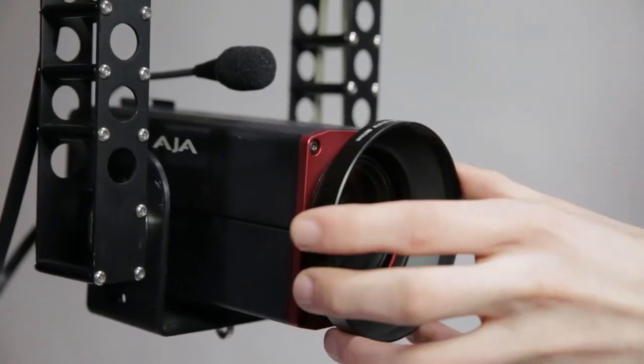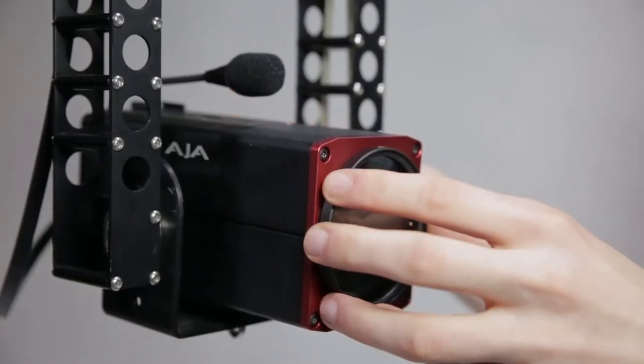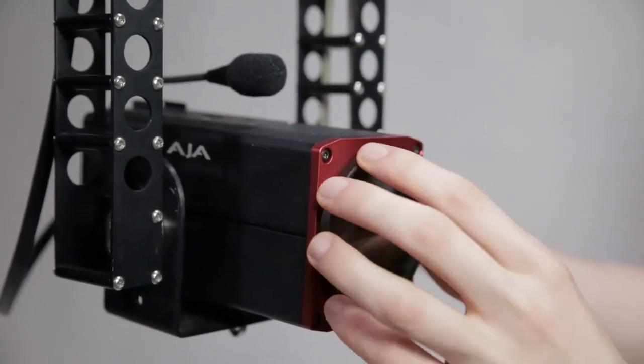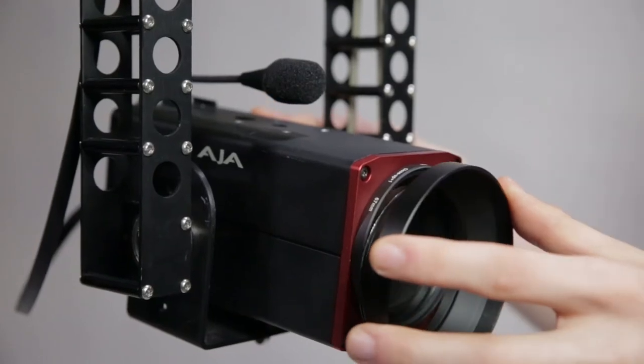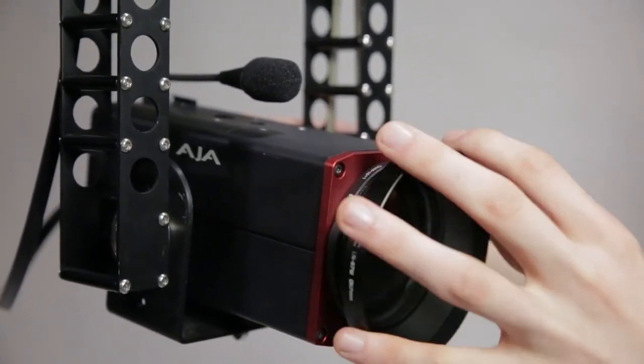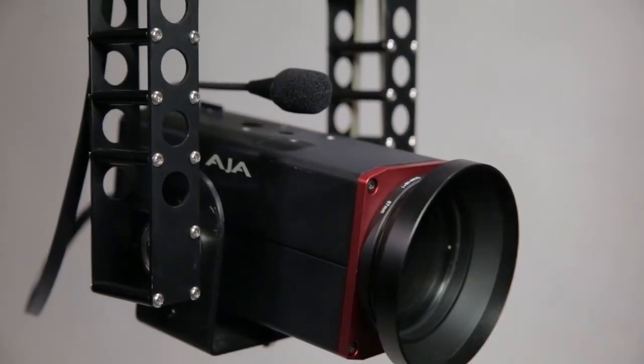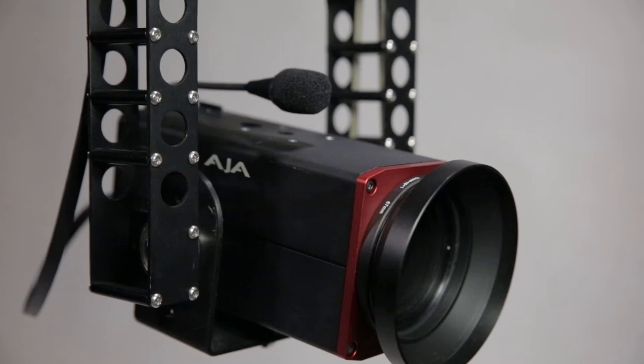Included in most kits is the plus-one diopter for the lens, which will reduce the minimum object distance of the camera from 1.5 meters to approximately 700 millimeters. Please note however that with the plus-one diopter, when zoomed in tightly, infinity focus is not possible. If this is required, we recommend removing the diopter.